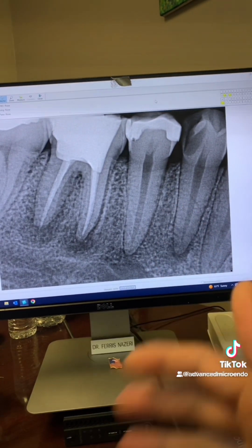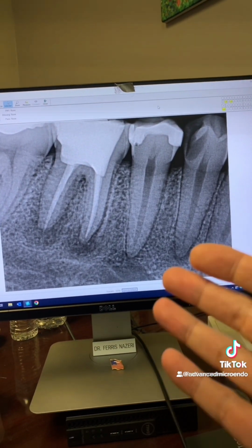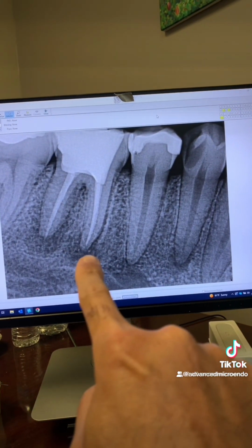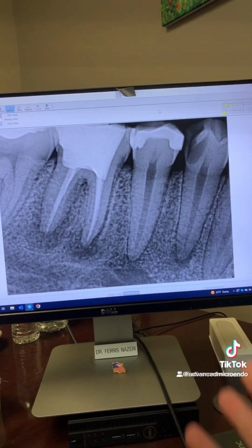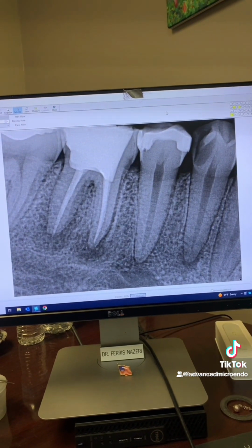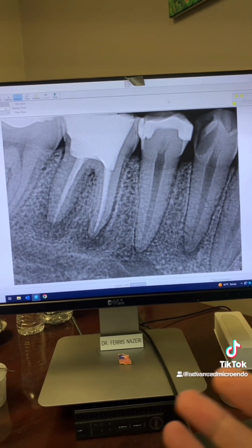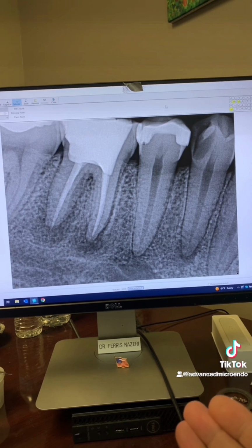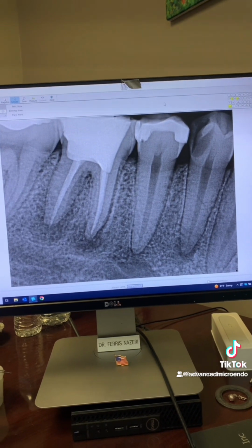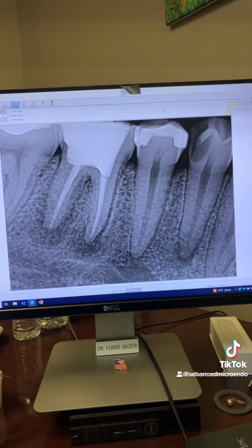And I've posted many videos in which I have proven to you guys that I do 99.99% of my root canals like this, or endodontic retreatments like this, in one appointment. And I've shown via post-op, many months or years post-op, that I hope I've proven to you guys that one appointment endodontic treatment or retreatment is as good, maybe even better, with better success rate than multiple. So there's no need for an intracanal medicament in most cases. Intracanal medicaments such as calcium hydroxide.